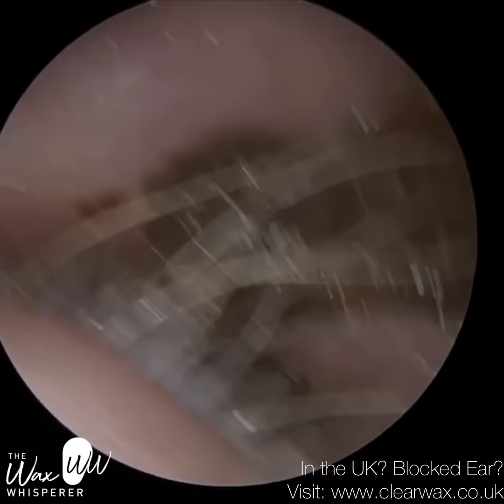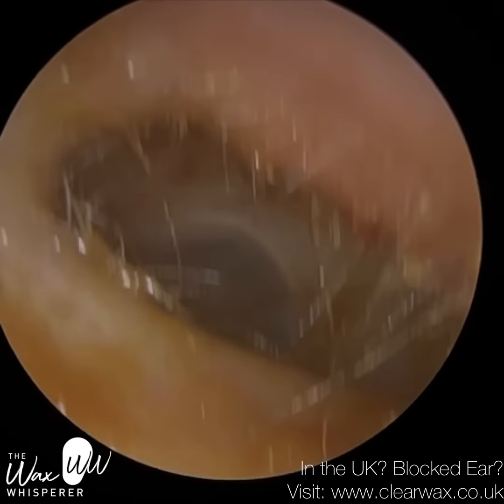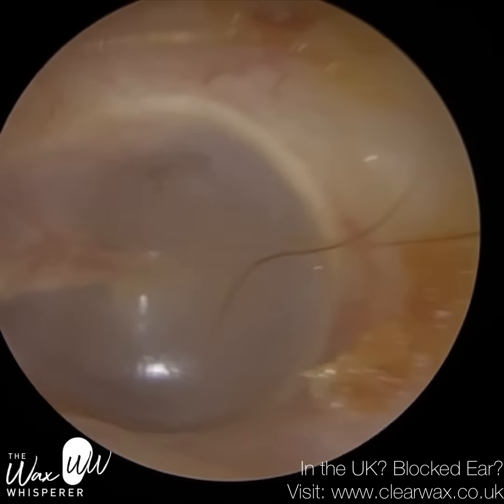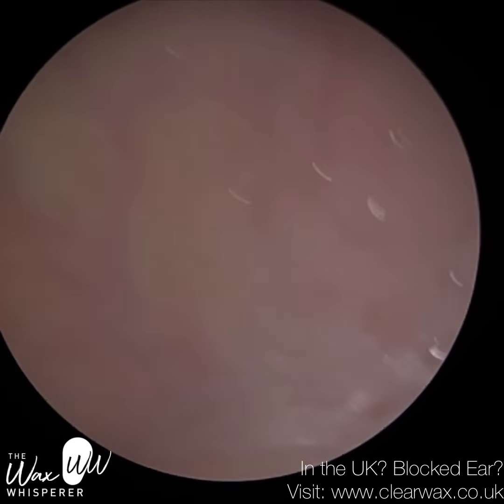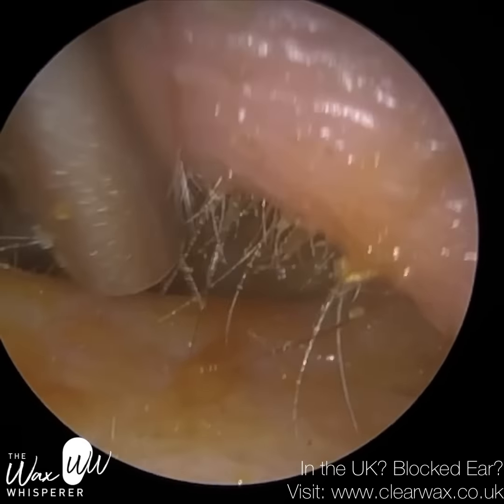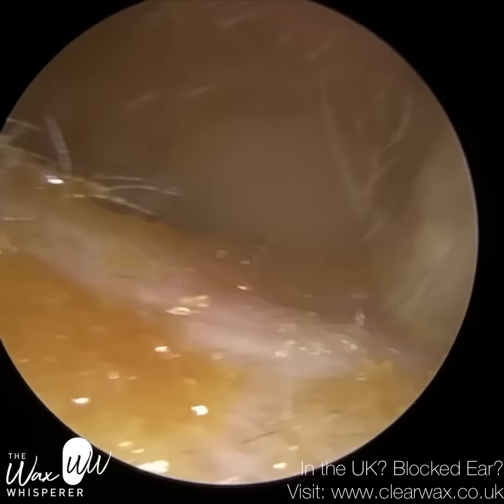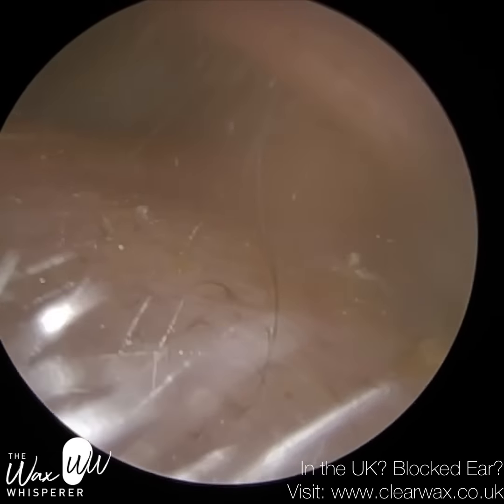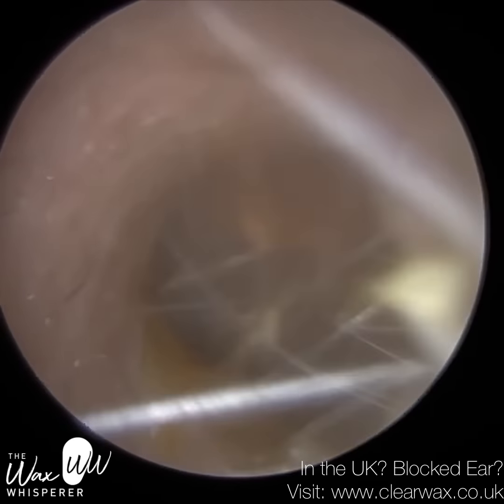Oh, no, it managed to tag along. You can see there's a bit of skin that's connected the top part of that wax plug against the bottom. That's the patient's eardrum. That's nice and healthy. Again, it's just a bit of debris around the edge. We're not overly concerned by that. We don't want to traumatise the bony part of the ear canal, in particular with the eardrum. So I'm just mopping up near this entrance. As we're bringing the wax plug through, it just coated and stained the ear canal.